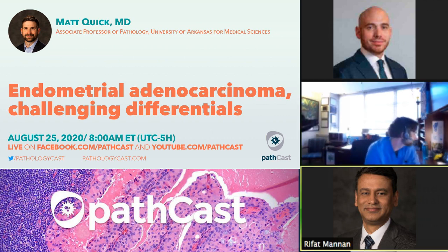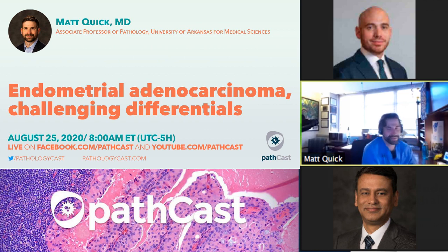Thank you. The next question is a little different. This is from Jayati Datta Mukherjee. Endometrial serous carcinoma versus grade 3 endometrial carcinoma. Would you use P16 given the fact that WT1 can be patchy in endometrial serous carcinoma? Yeah, that is a tough question, and I'm glad you asked about that because I like to bring that up again and again to my friends and colleagues.